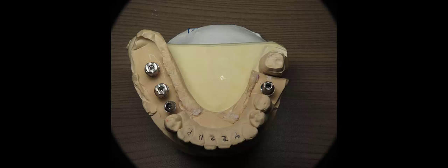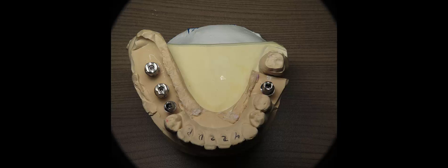The teeth are made actually individual and not splinted to each other. In the lower jaw, if the implants are long enough, they can be made as individuals.